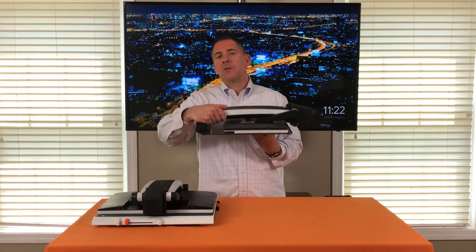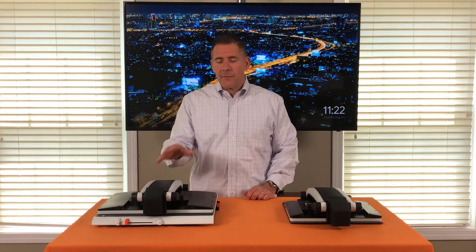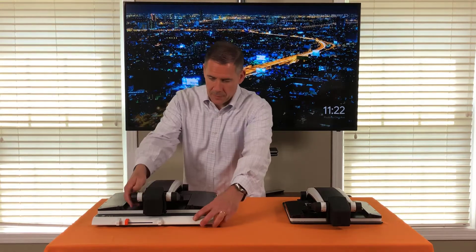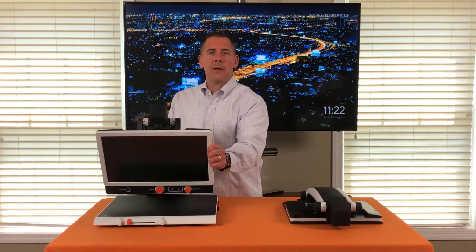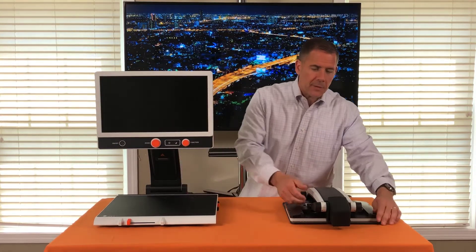foldability and transportability. On my right — your left — I have a 17-inch system with an integrated XY table. To open the Zip, you pull the screen around and it's ready to go.